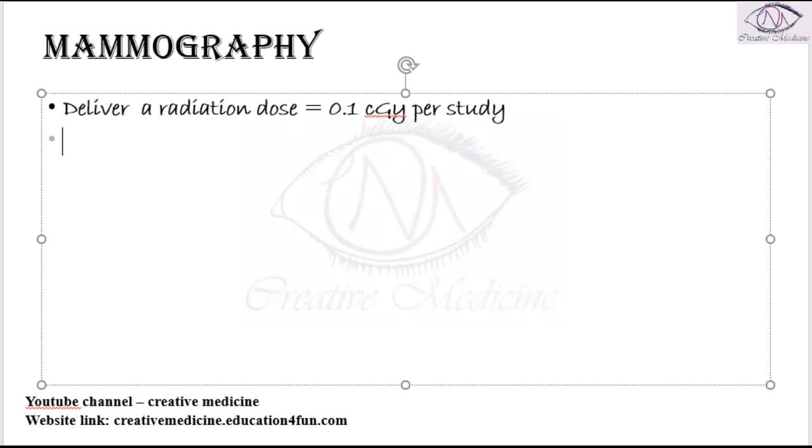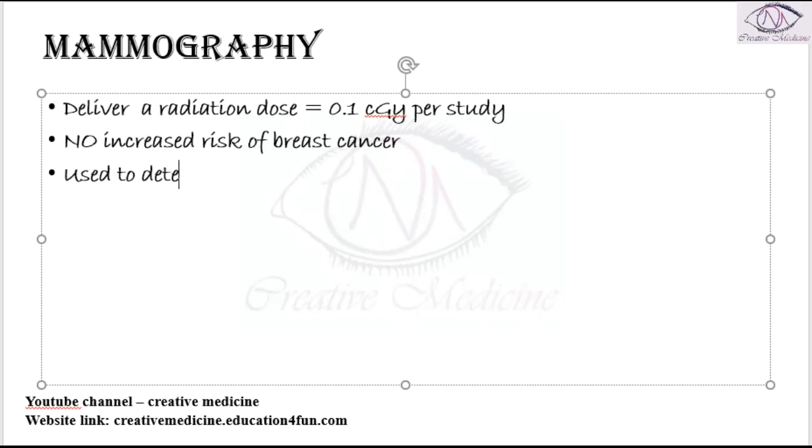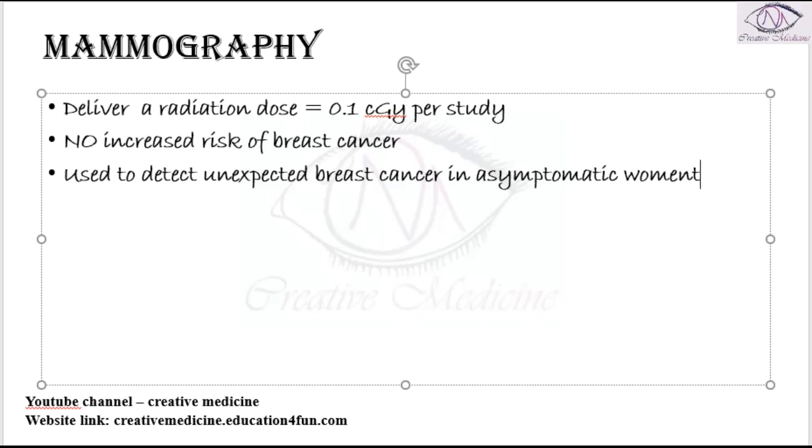With screening mammography, no increased risk of breast cancer is seen. Mammography is mainly used to detect unexpected breast cancer in asymptomatic women. That is, it is used in screening of breast cancer, which is nothing but screening.